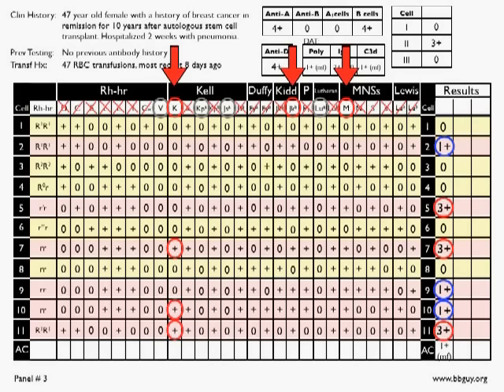So let's actually move on and let's look now at JKB. JKB actually does explain every single reaction in terms of every place JKB is present, there is a reaction. And in addition, if you'll notice, every place where JKB is only single dosed, you have a weaker reaction, and every place where JKB is double dosed, you have a stronger reaction. I would say that this is actually a perfect fit for anti-JKB. But we need to look at all of them, so let's look at anti-M, and you'll see anti-M actually explains a lot of these, but doesn't explain cell 2.